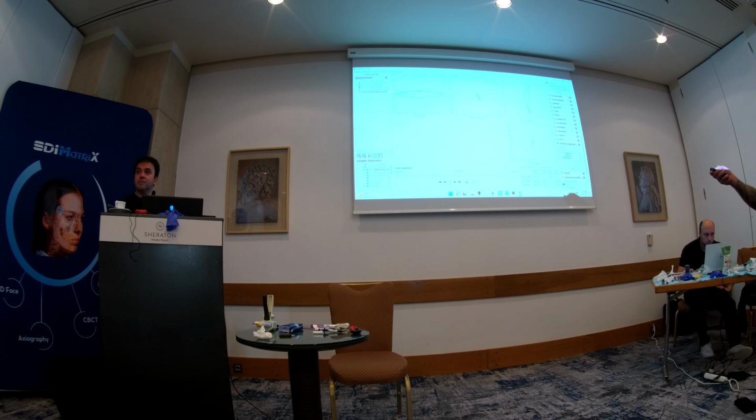Please, protrusion. Protrusion. And the protrusion is going, let's see, can you see from the top? Just a moment. I think, yeah. Did you see the glitch? It's because I switched on computer tomography here. So from the top? And remove the open model.